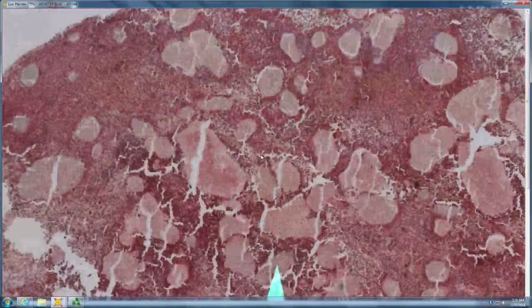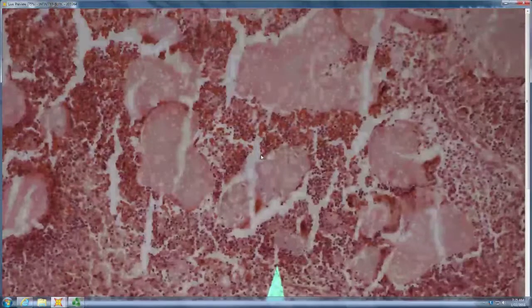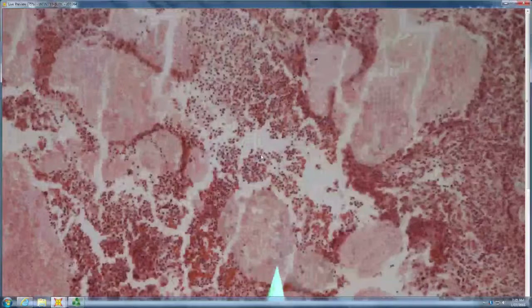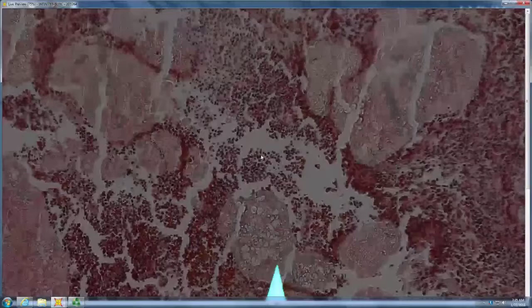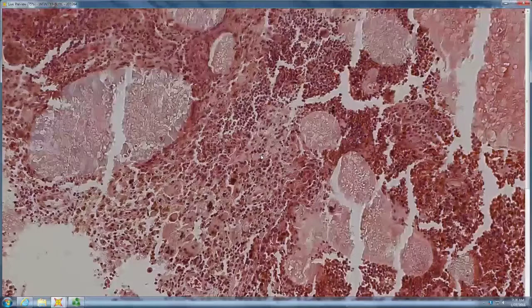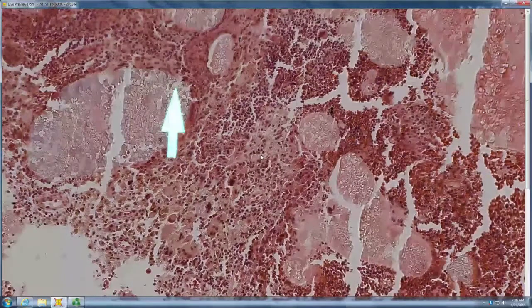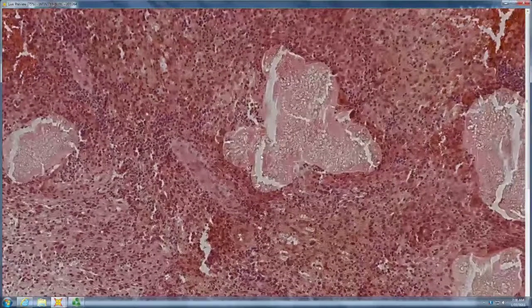Okay. Well, looks like you have fungus surrounded by immunoglobulins. Yeah, so you would refer to that as a eumycetoma, and you can see those balloon-like swellings, chlamydospores. So that usually means a black mold. In this case, it was actually M. canis mycetoma.